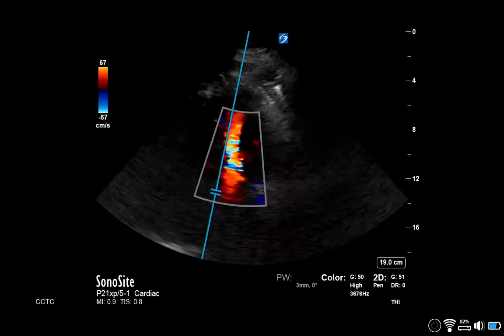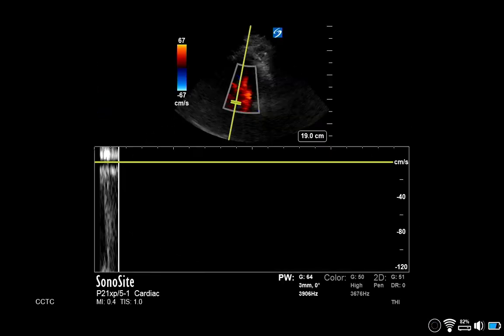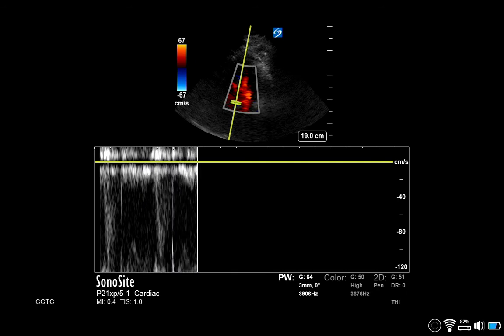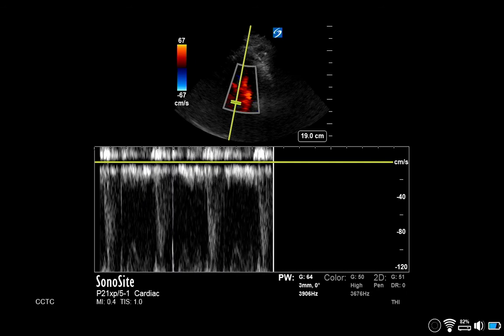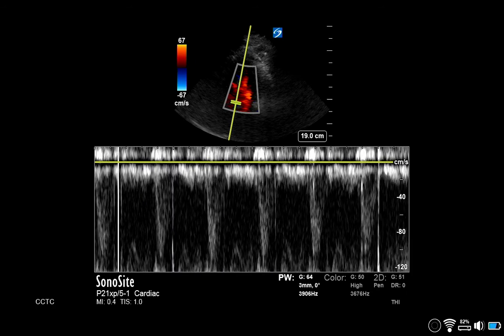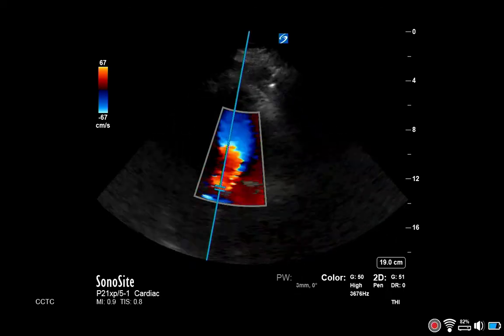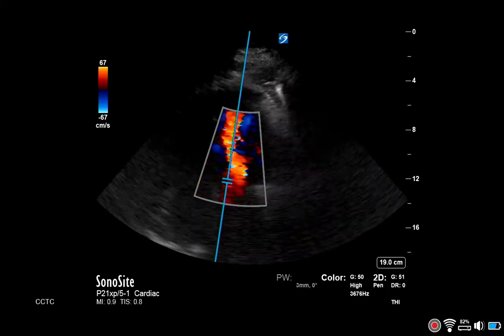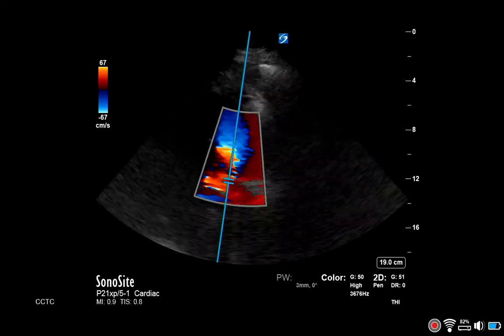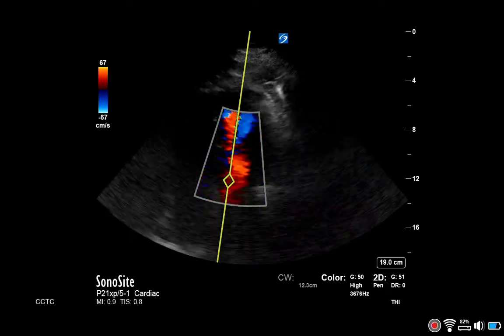Last, position over the aortic valve. This shows normal aortic valve flows. Once you've identified the region of most significant aliasing, change to CW and align the beam with this region.